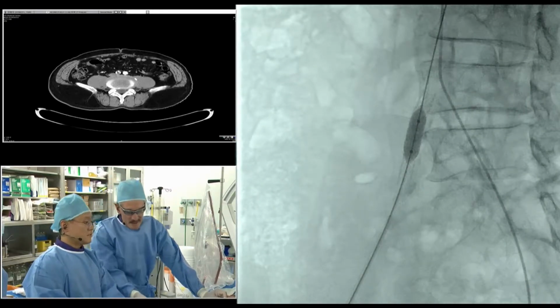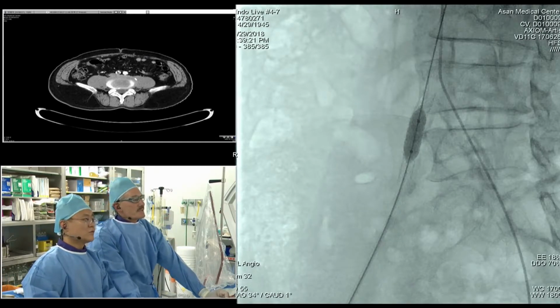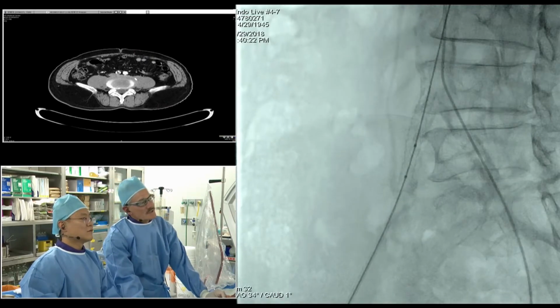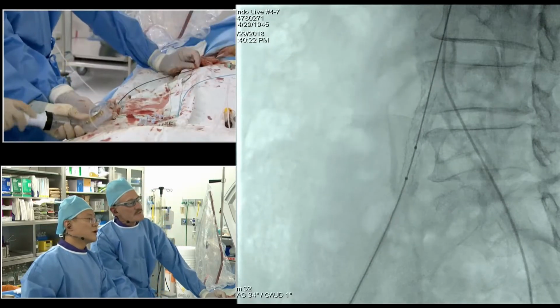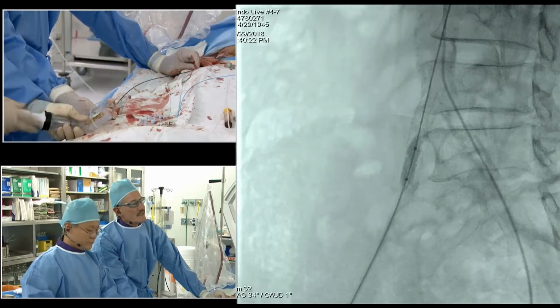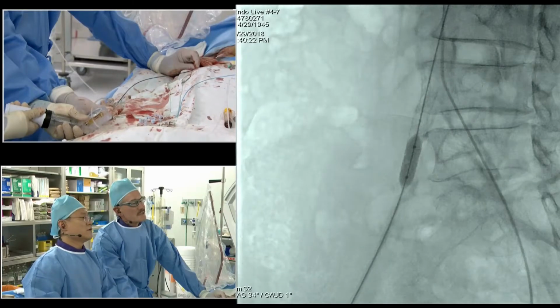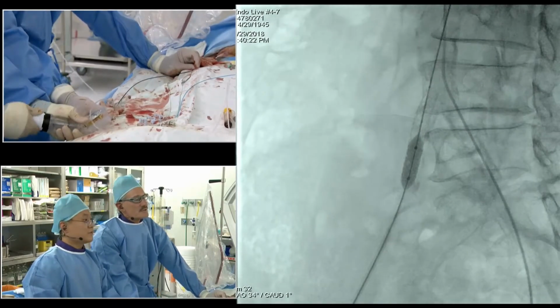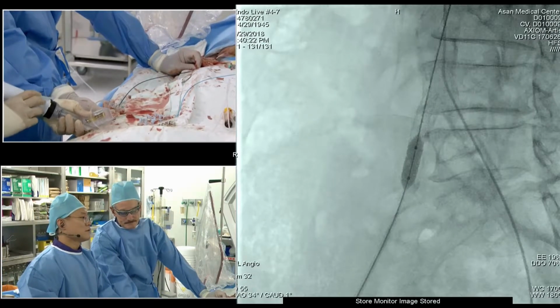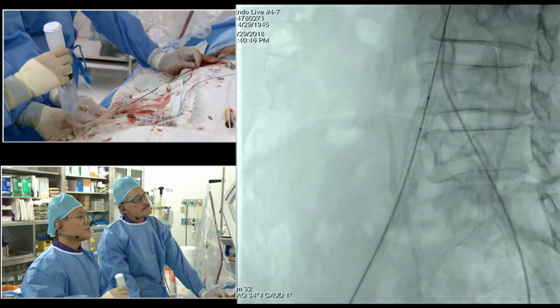It's a 7 millimeter diameter self-expandable stent, right? No, LifeStream is a balloon-expandable stent graft. It's a long segment CTO. Now go easy here, just 2 atmospheres. We're at the lower end here. And now we're post-dilating with a 9 millimeter balloon. Okay, that's good. And he's had no pain throughout. Usually self-expandable stent sizing is slight oversizing, but how about the stent graft?